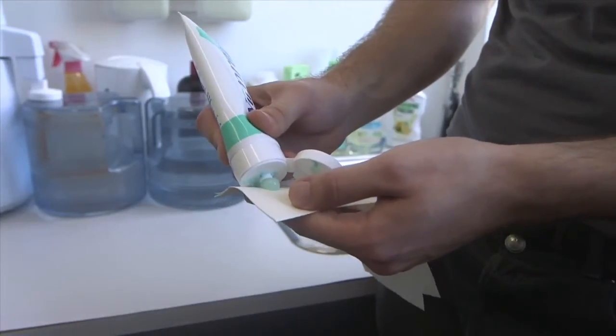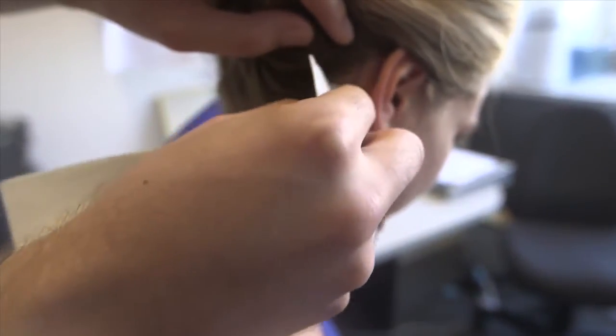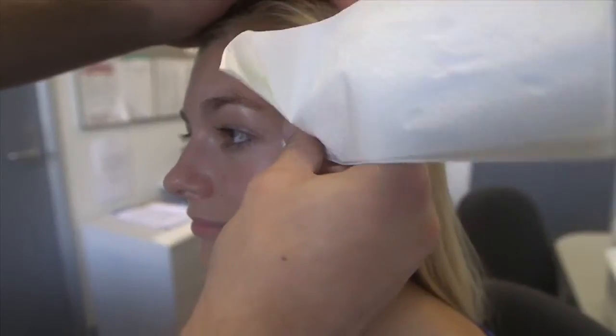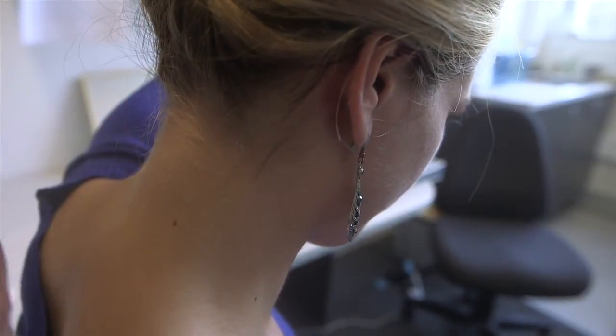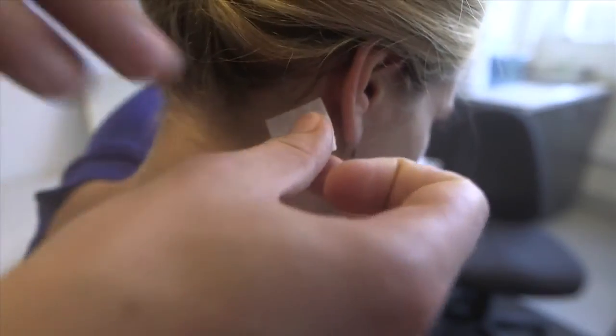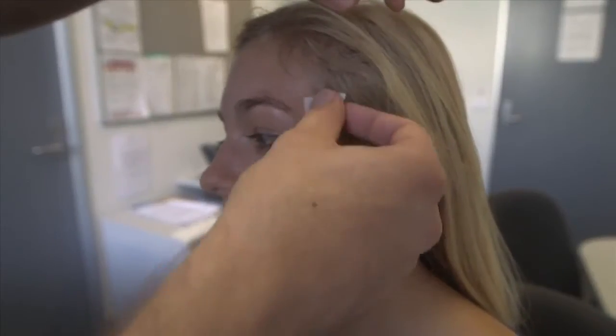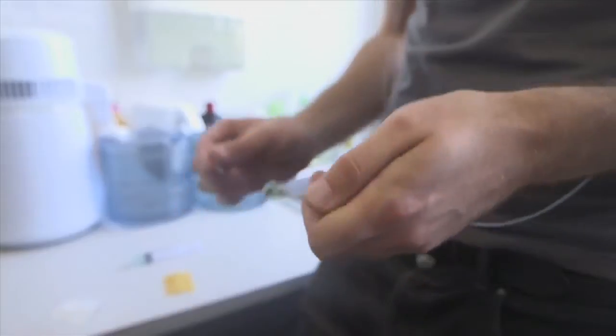First, clean all four areas with NuPrep gel. Clean behind both ears, next to and underneath the left eye. Then, wipe off the NuPrep gel using alcohol wipes.